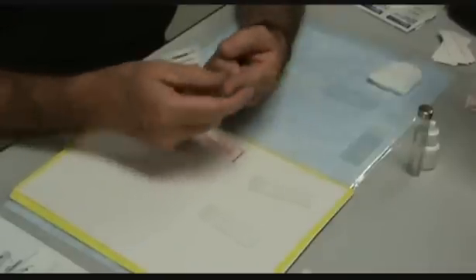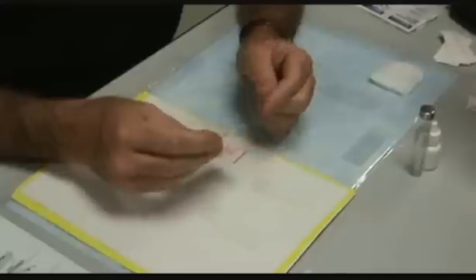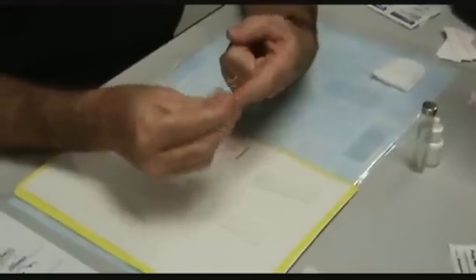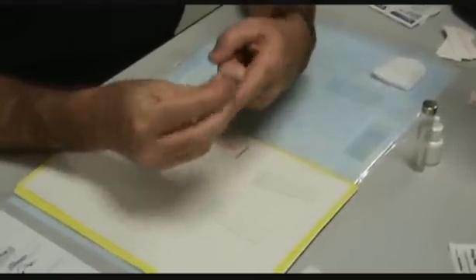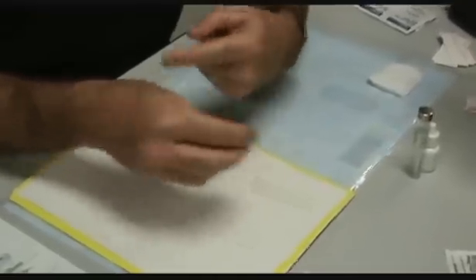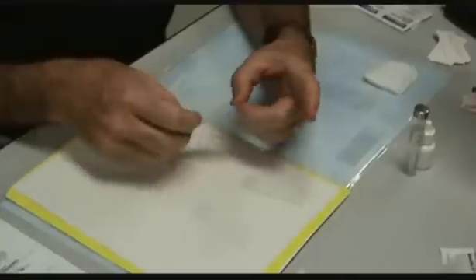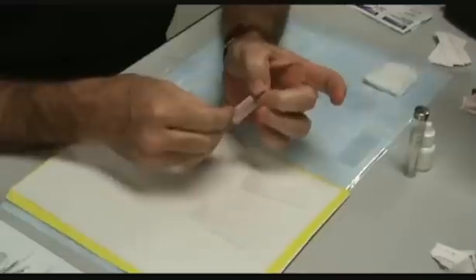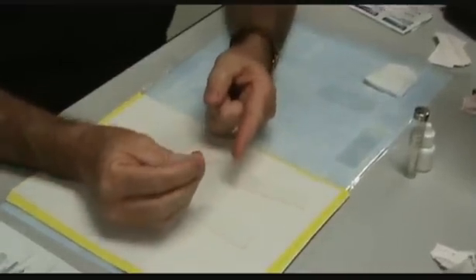Okay, for starters, I'm going to take a little blood smear from myself. Of course, the way to start things off is to make sure that the patient's digit is nice and clean. So I'll try and do that. And then we're going to take this nice little lancet. And here we go.